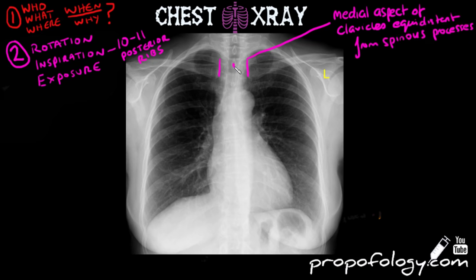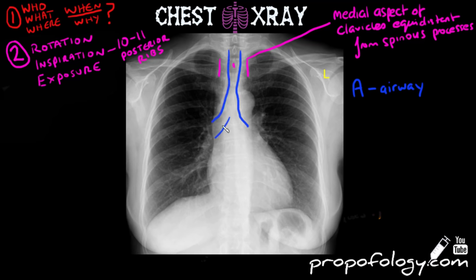Then you're going to adopt an A, B, C, D, E approach to interpreting chest x-rays. A obviously stands for airways, so we're talking about the trachea and its branches, the bronchi, and any airways you can see distal to that. You're going to trace it, look down either side, and look in both lung fields as well.